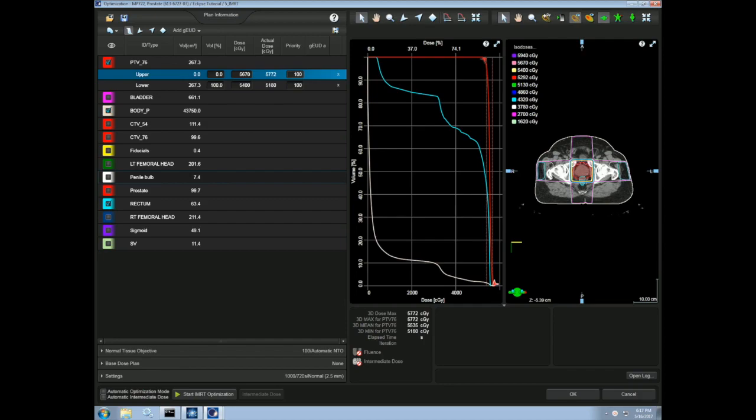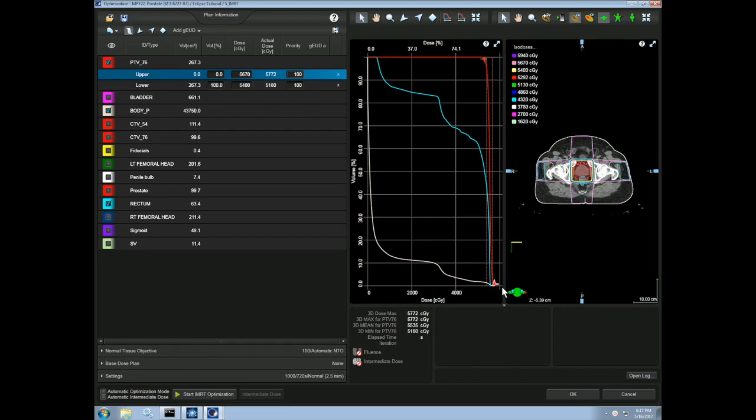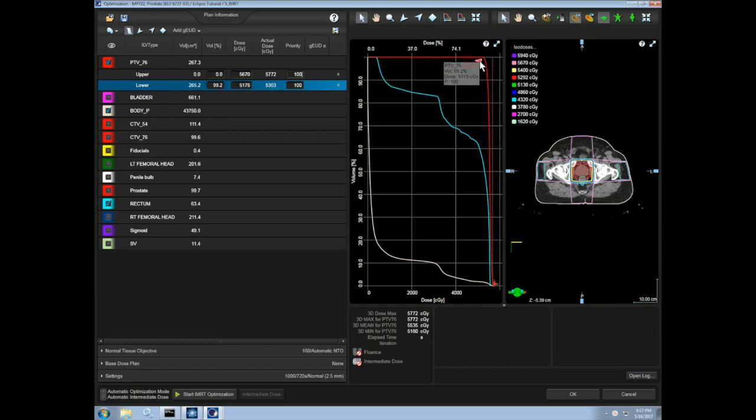As you can now see, we have arrows on our DVH. These are the constraints that we just added. If our constraints are properly met, our dose will go over the lower constraint and then come down under the upper constraint. This gives us a rapid drop falloff and hence a homogenous dose distribution. We can also manually drag these constraints on the DVH.